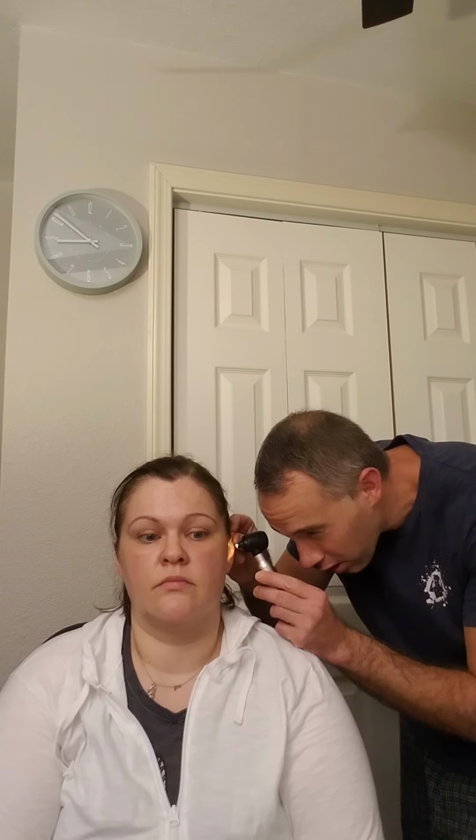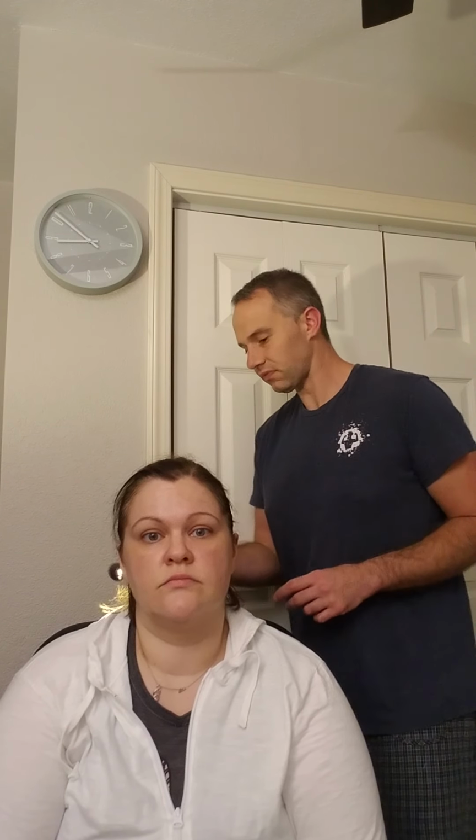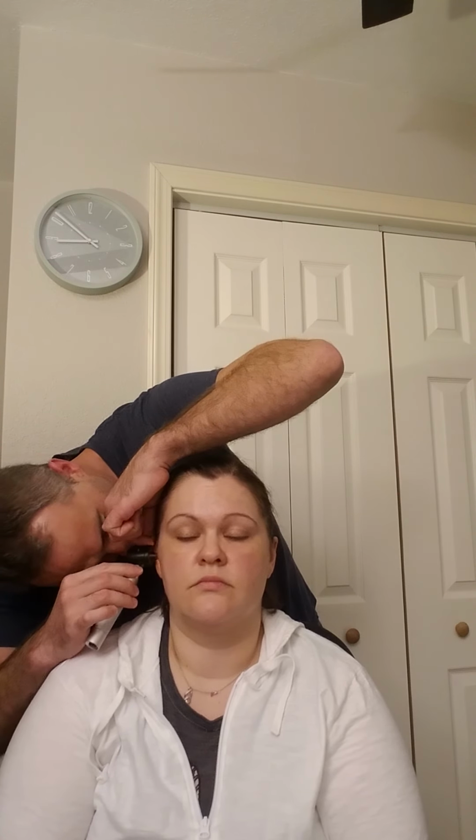I'll also look at the tympanic membrane to make sure that it's a gray, sort of opal, pearlish color. Look for any perforations on the tympanic membrane, any bleeding, any redness or swelling on the tympanic membrane, any drainage of any kind that would suggest a middle ear infection.